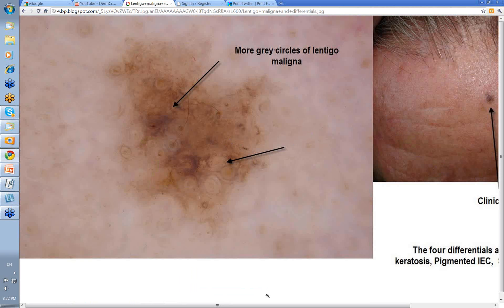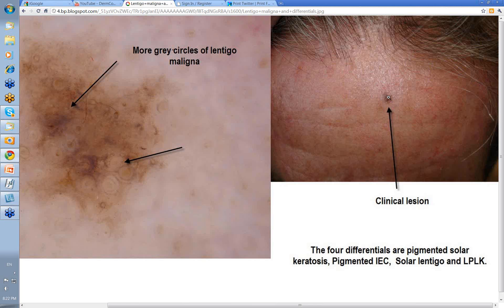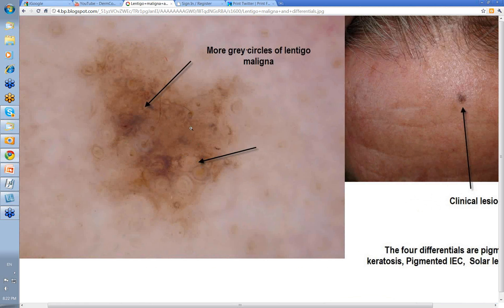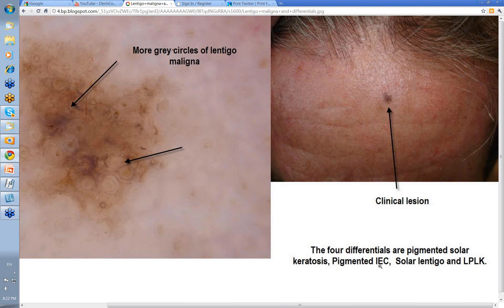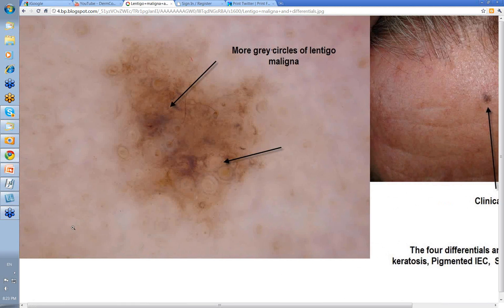Then this one here. This was the clinical lesion — difficult to say what it was unless you put your dermatoscope on it. Then up come these gray circles of lentigo maligna. Remember, not all gray circles on facial lesions are going to be lentigo maligna. The four differentials are: lentigo maligna, lichen planus-like keratosis, pigmented intraepidermal carcinoma, and pigmented solar keratosis. Most solar lentigos don't actually give gray circles. I'll get that corrected in the blog. I like putting in mistakes — we both learn from that.